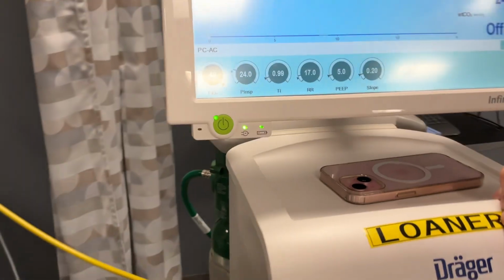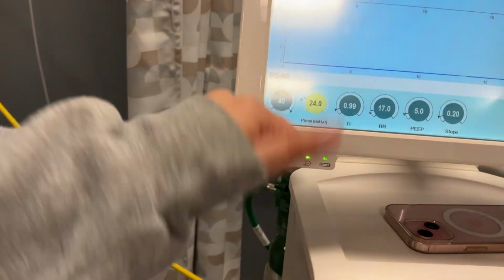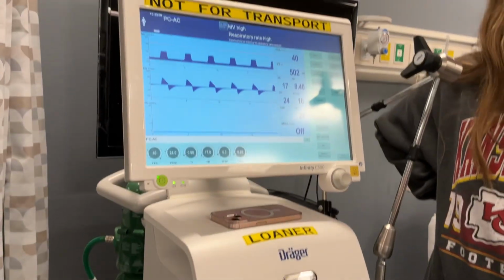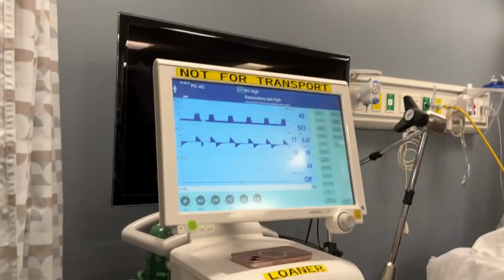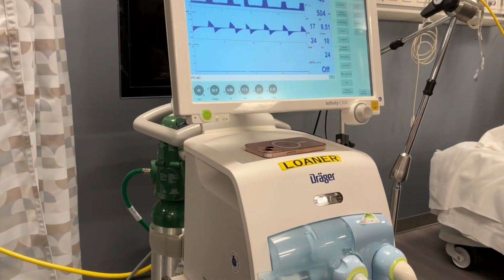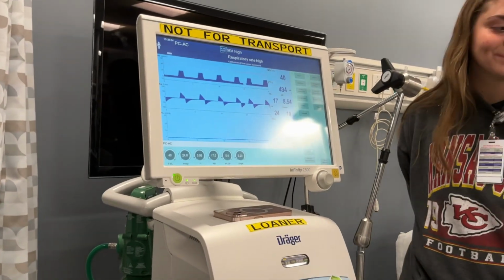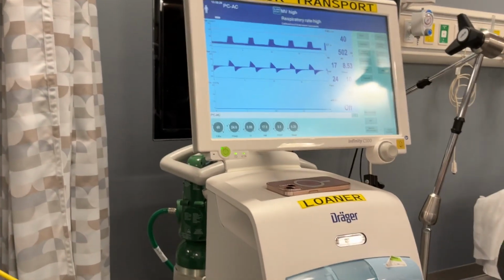You're never going to get it exactly at 500, right? But I'd rather have 505 than like 490. We want 500. And the respiratory rate, do we do the same thing as the other one? Match the ventilation? It doesn't give you a CO2, so you can't do that equation. So it's basic. It just wants you to increase the respiratory rate. Either increase respiratory rate or increase tidal volume is what we're looking for you to think of. It's not that in depth to where you have to do that CO2.